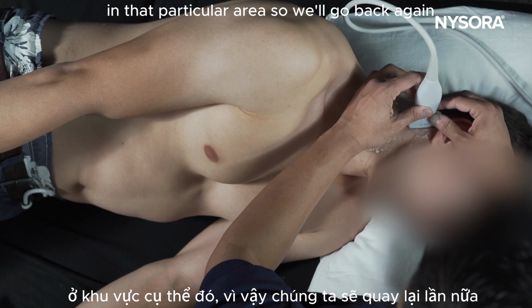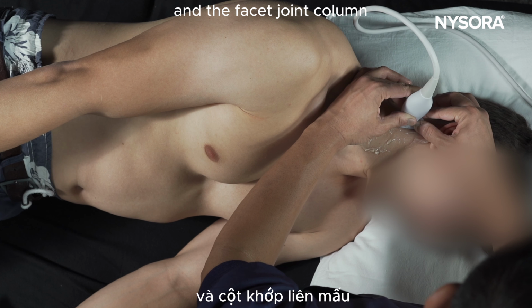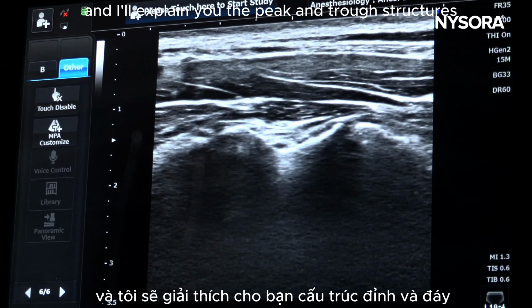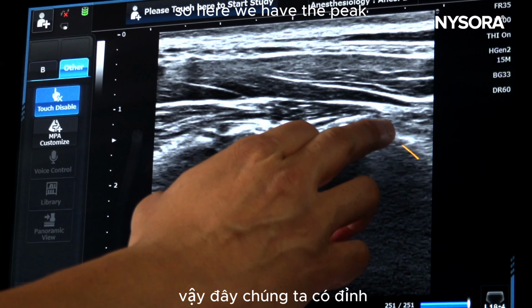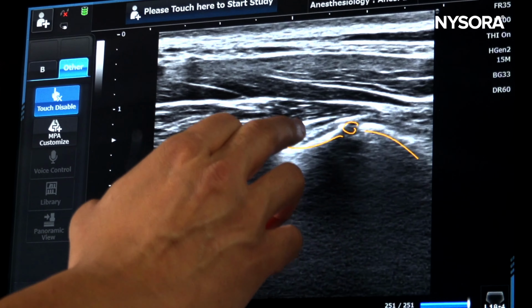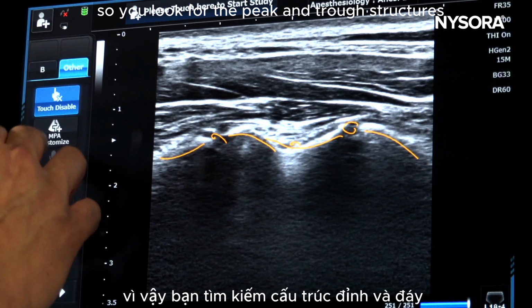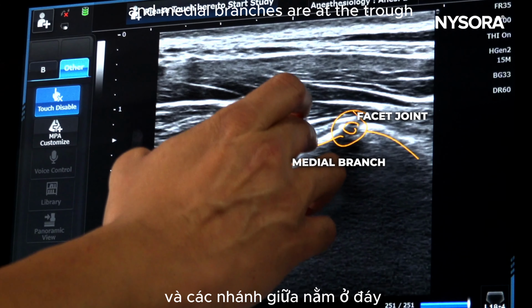So we'll go back again and I'll show you the whole cervical medial branch and the facet joint column in one view, and now you can see the whole image quite nicely shown here. And I'm going to freeze this and I'll explain the peak and trough structures. So here we have the peak, and the peak is where you have a joint, and then you have a trough. The trough is where you have a medial branch. Then you have another peak, that's the joint, and then you have a trough. So you look for the peak and trough structures: the facet joints are at the peak and medial branches are at the trough.